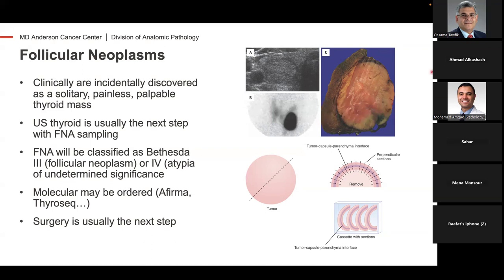And I can't emphasize enough how important it is to thoroughly and extensively sample these tumors. Okay. And this is what they look like grossly.